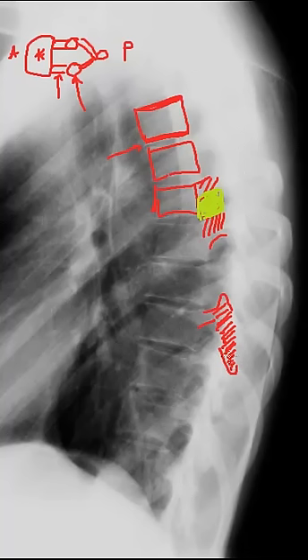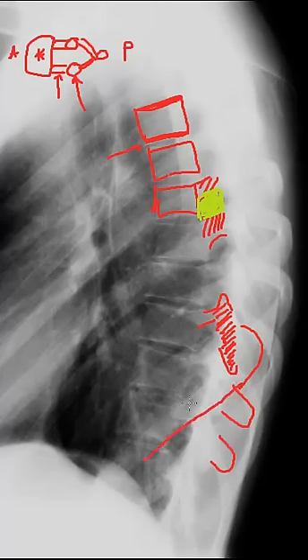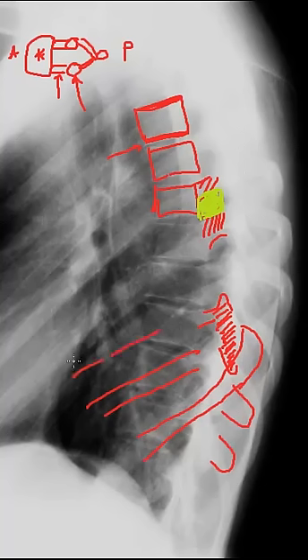We cannot appreciate lamina or spinous processes very well. But if we look ever so closely we can see a spinous process right here, and maybe right here. What you'll understand is that anything posterior to the articular pillar is not well seen on radiographs due to these structures which like to wrap around and come anterior — these are the ribs. You'll notice there are several ribs here, and one of the dilemmas is that we're seeing both right and left ribs superimposed over each other, which can become quite a mess on the lateral projection.